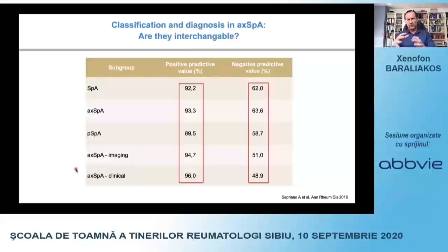And by that, in order not to make it too complicated, I remind you that the classification criteria use sacroiliitis as the imaging finding for spondyloarthritis. However, we may be able to make a diagnosis by using the spine MRI, and I will show how to do it later on.